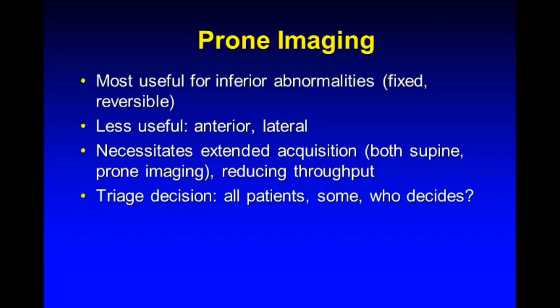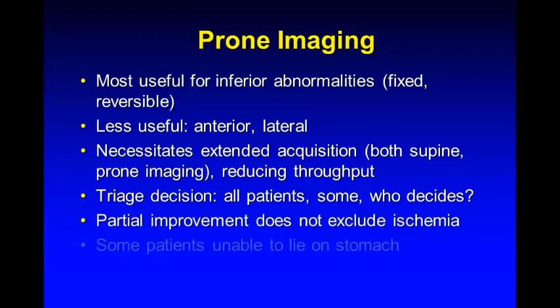It necessitates additional acquisition. And if you decide to do it on everybody, or you're going to do it when someone checks the images, the logistics of the labs might vary. You might not always have a physician in your vicinity while you're imaging to check your images. So there are some practical issues to doing it, unless you decide to do it in all patients.